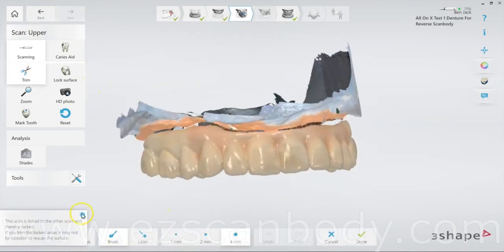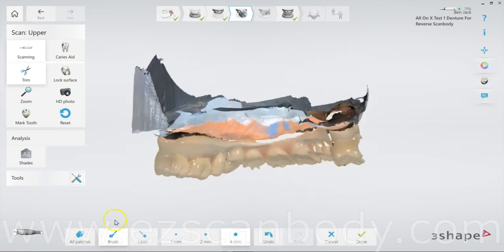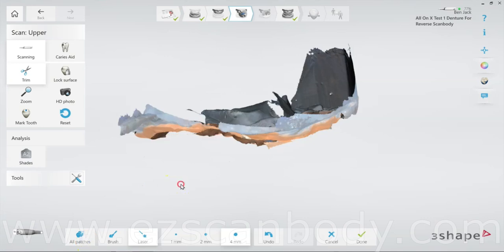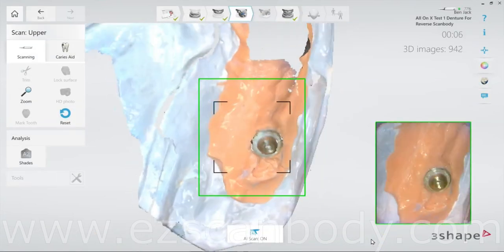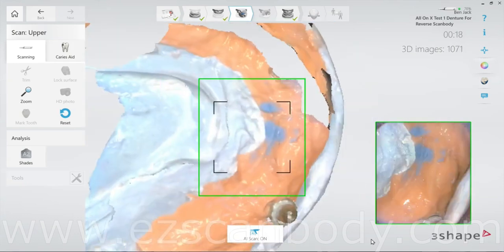To scan the jaw completely, we need to cut the denture from the pre-op scan. Position the scan for easy trimming, then click Trim and carefully cut the denture. Make sure to leave the gum intact at the borders. When stitching, start from the existing gum and gradually move forward into the cut area for smooth alignment.